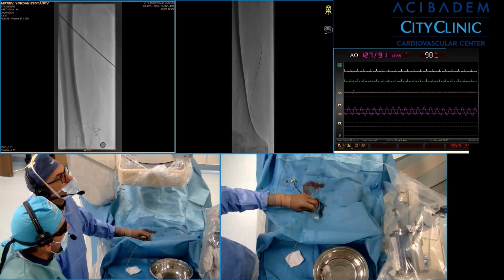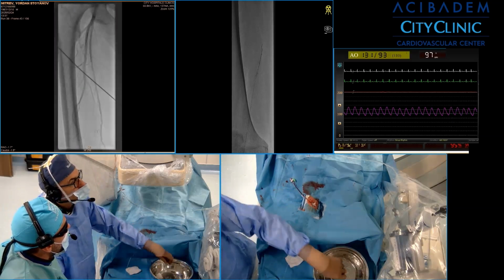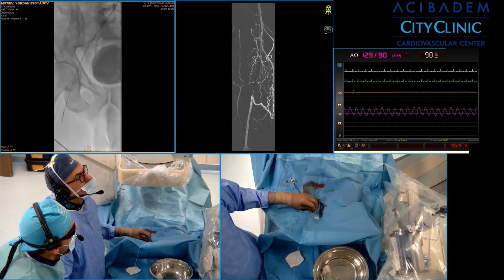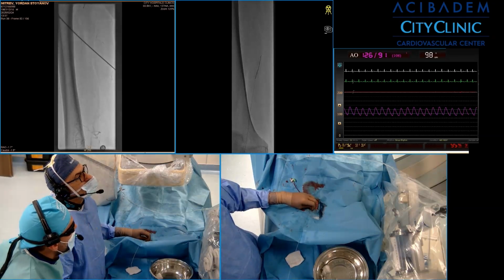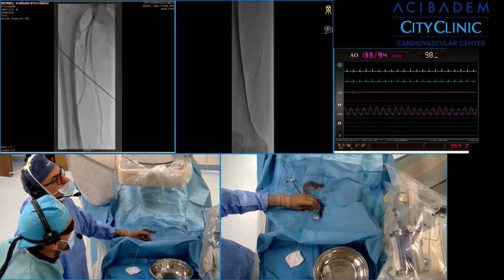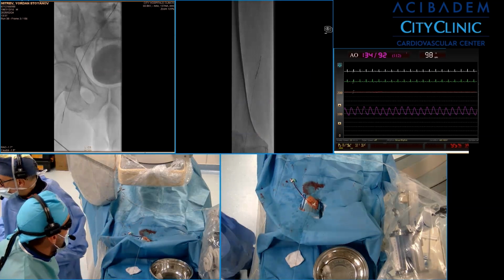What kind of catheter do you use? Support catheter? This is a 018 Trailblazer supportive catheter, Trailblazer from Medtronic, yes. We advanced slightly, and we can choose even a coronary Gaia the Third, for example, to penetrate the cap. This is again subintimal. Okay, let's try Gaia the Third.